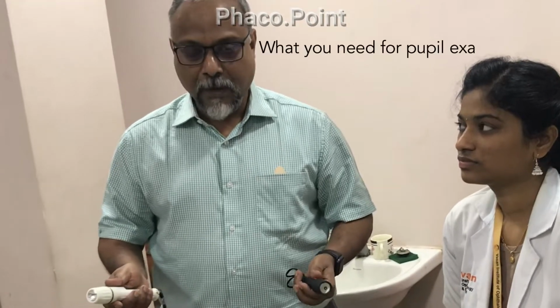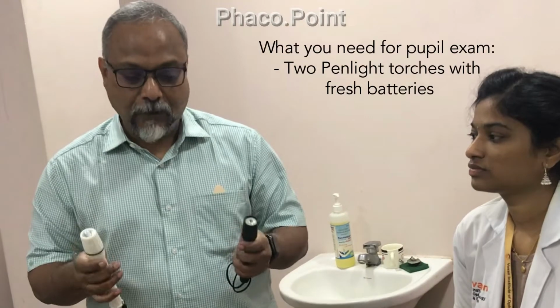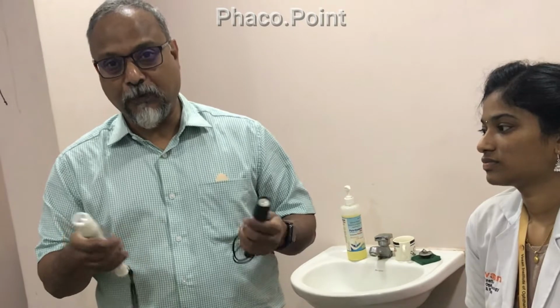Before you even attempt to do a pupillary exam, you need to have certain basic paraphernalia. The equipment that you need is two torches. A mag-light torch is preferred, but make sure that the torches have fresh batteries and the light is nice and strong. Because if you have two torches of varying intensity, then you will get different types of pupillary reaction.